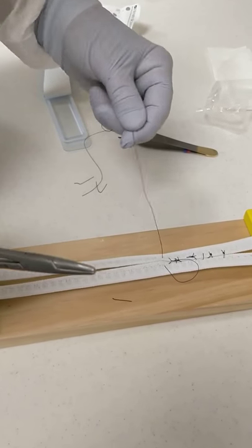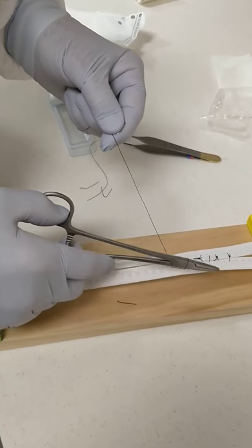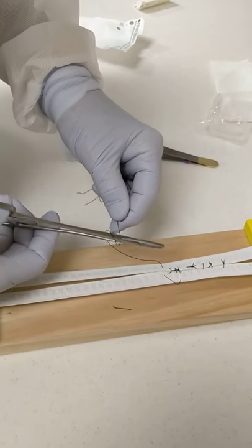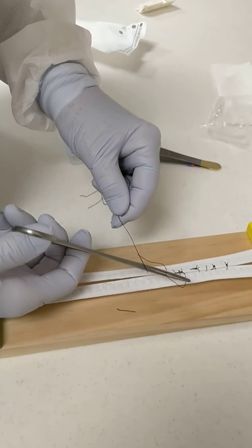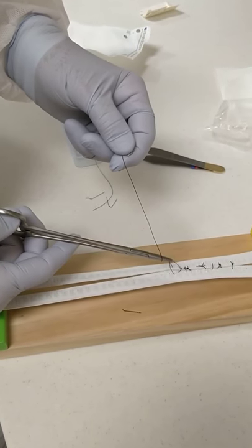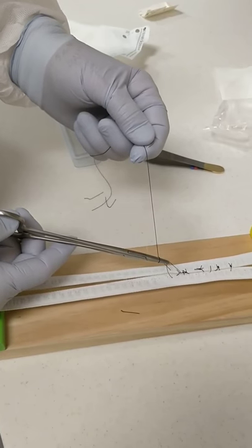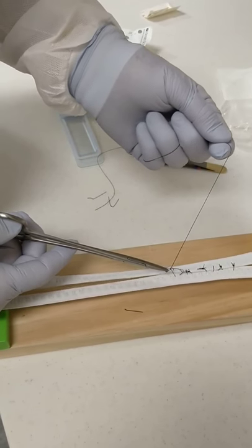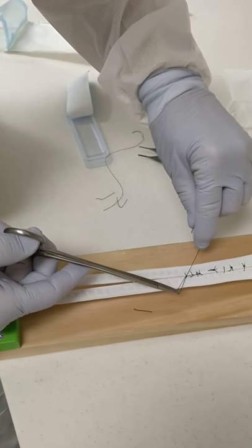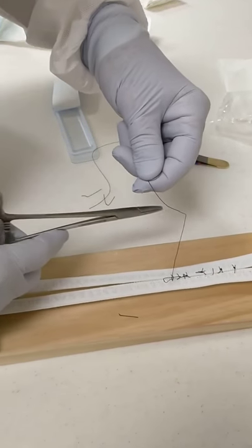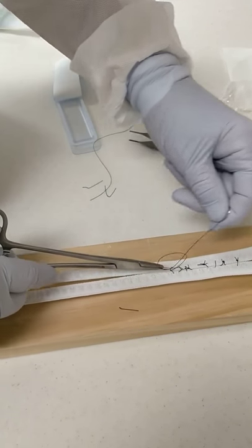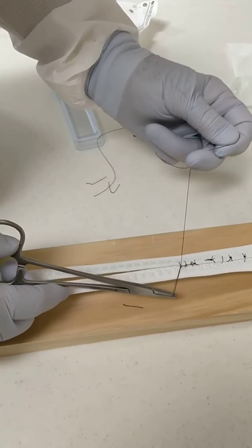You pull this through so that you've got about an inch or so of loop there, a single tie on your suture. The reason for doing just a single with this is that if you double tie it, it's hard to push the knot down, it'll crumple up on you, makes it hard. You do it like that, this does just the opposite, it makes it so that it comes apart.